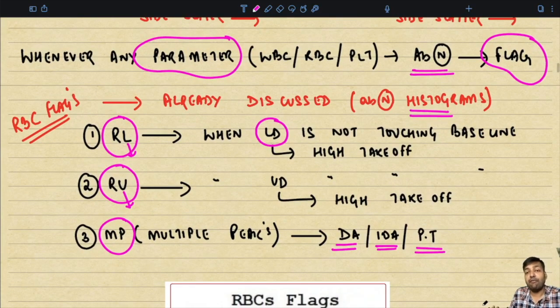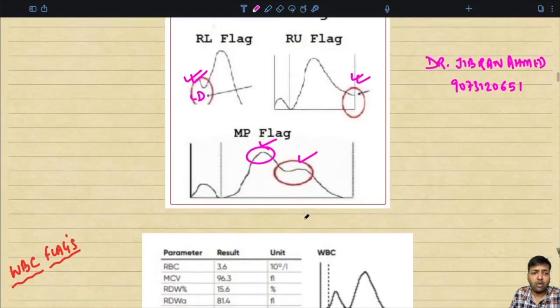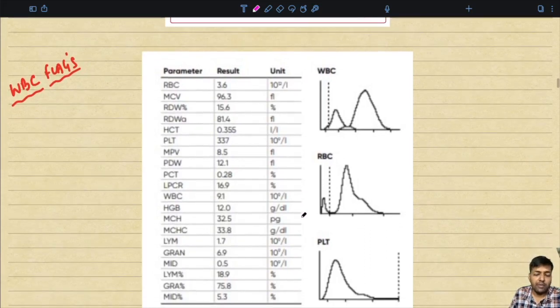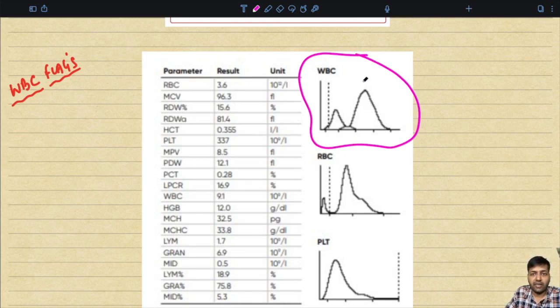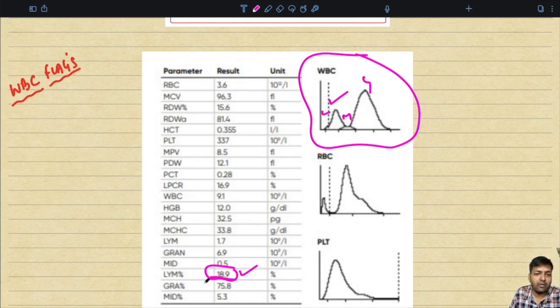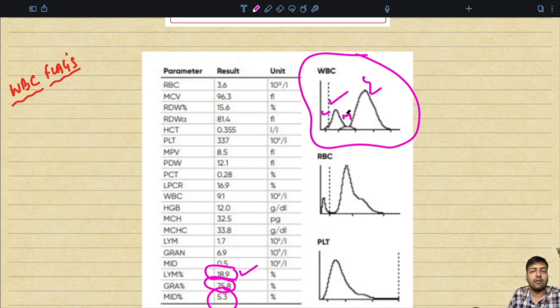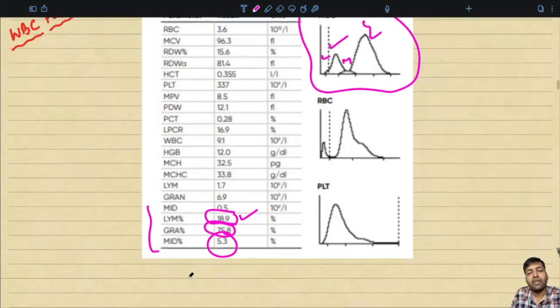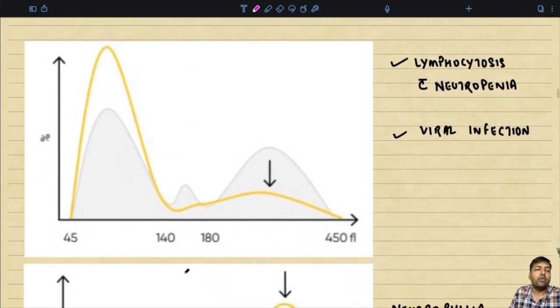When a machine reading shows a flag, it mandates examination of that case using the peripheral blood smear. Looking at WBC flags: in a normal WBC histogram, lymphocyte percentage is around 18–19%, the granulocyte group is around 75%, and the mid is around 5.3%. Everything in normal range produces a normal-looking histogram. We will now examine the WBC histogram in relation to abnormalities.